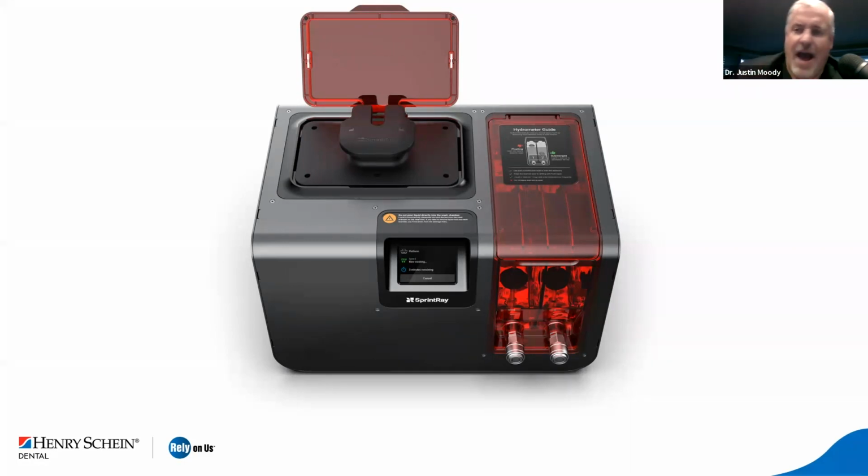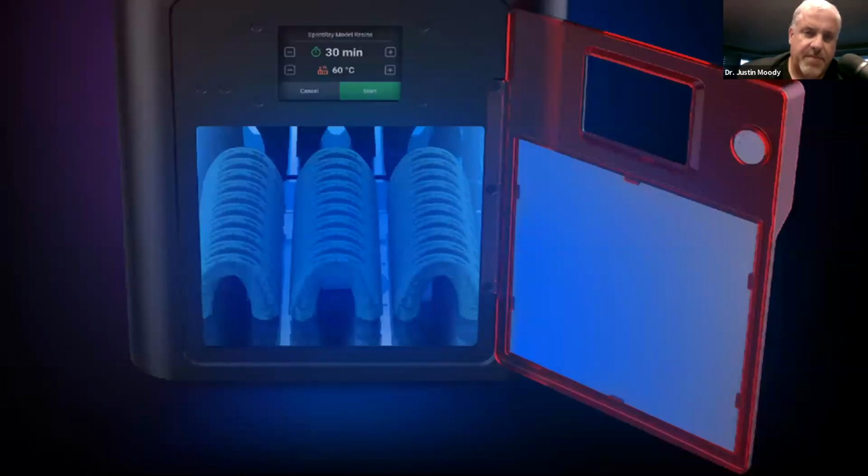And I know of no other system out there that has this technology. And the cartridges come out, they're easy to clean, and it just looks good. And I know from some of the beta testers that this thing works like a champ.